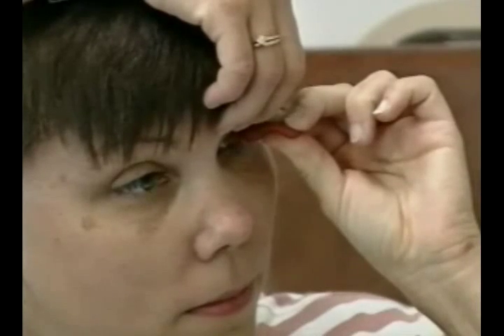To remove an artificial eye, gently lift your upper lid to expose the iris of the eye. Squeeze the shaft or stem of the suction cup and firmly press the cup against the iris. Take care to assure even and full contact with the suction cup. It may be helpful to wet the end of the suction device to assist in attachment. Once you feel you have good contact, release your squeeze on the stem without losing contact with the surface of the eye.